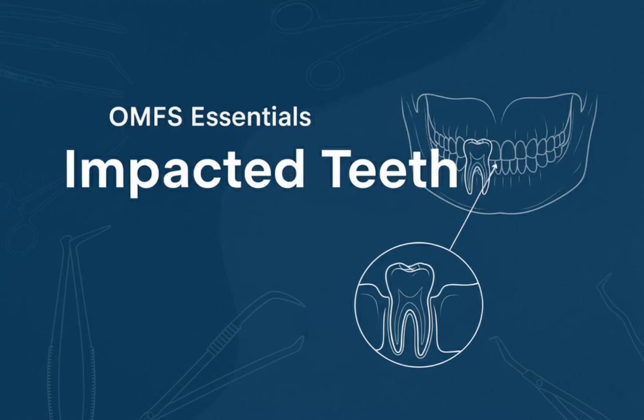Distolingual lock. The bone on the distolingual aspect must also be removed to eliminate the distolingual lock that often prevents luxation. Direct vision. Bone should only be removed under direct vision after carefully observing where the tooth is locked. Blind bone removal leads to unnecessary and excessive bone loss, weakening the mandible at the external oblique ridge. Odontectomy. Tooth splitting. Odontectomy is the planned sectioning of the tooth into pieces to allow its removal without excessive bone removal. The dictum is, tooth belongs to the surgeon, bone belongs to the patient.